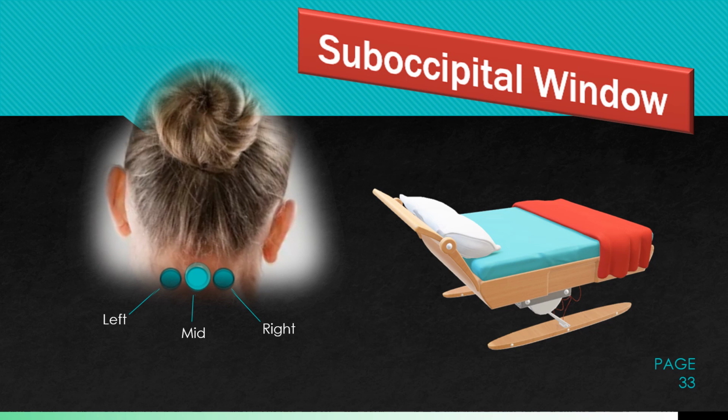Sometimes it's easy to slide the pillow up when you are scanning an inpatient just so that you can slide your arm up underneath the back of the head easily. Sometimes you can just have your patient's head turned a little bit to the right or the left so that you can get behind the head. Sometimes the patient's head straight, and with that pillow slid up behind the head will position that probe the best.